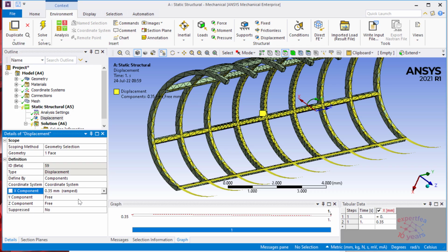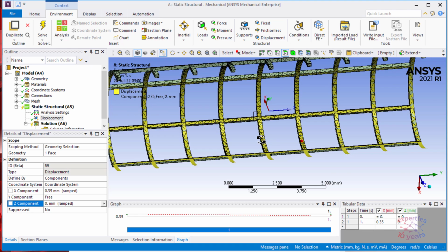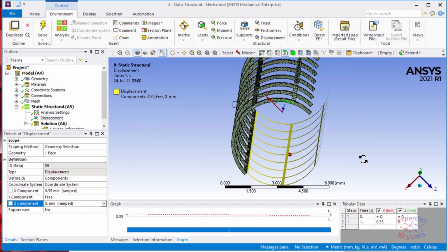We'll let the y component free, and we will make the z component, let's restrain it a little more. We will make it 0 to help the solving. So we will not allow a shortening of the stent at this moment. We want to help the solving.